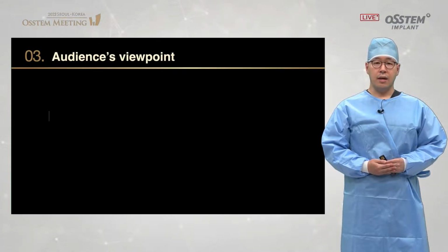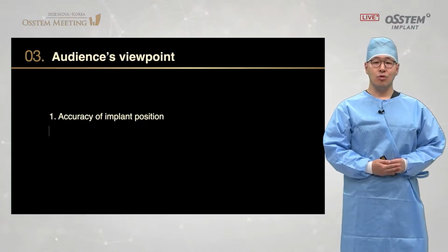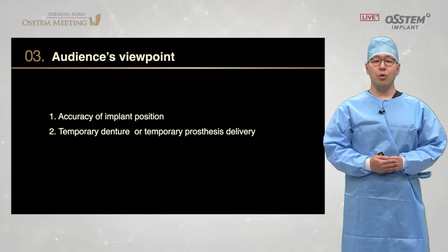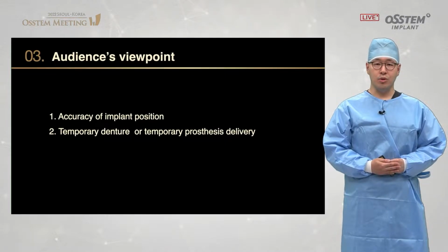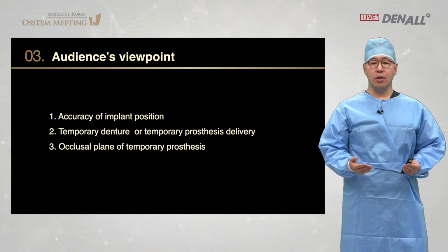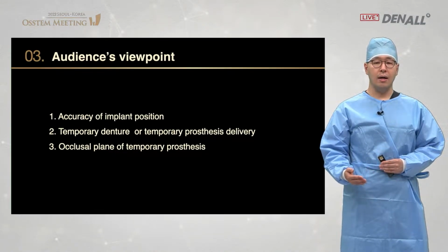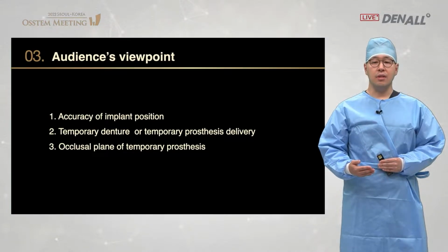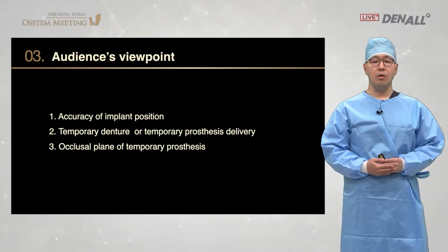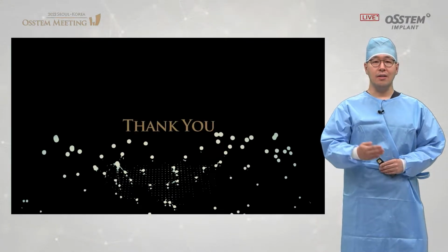So in today's live surgery, we are going to look at the accuracy of Osstem OneGuide system. Second, the temporary denture selection depending on the primary stability and occlusal plane of temporary prosthesis. And the convenience of a digital approach will be explained. Now let's get started with the live surgery.